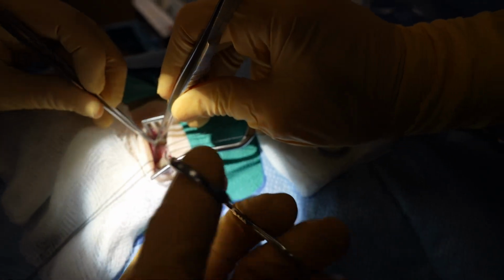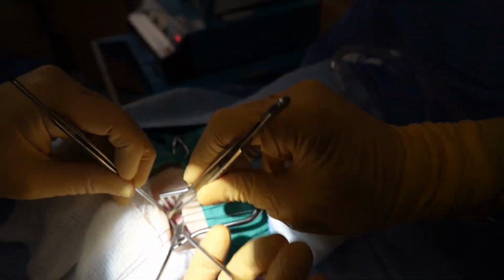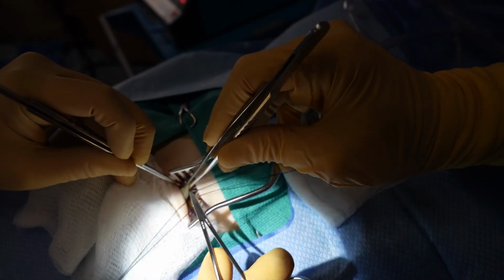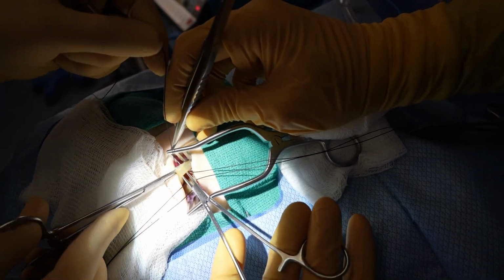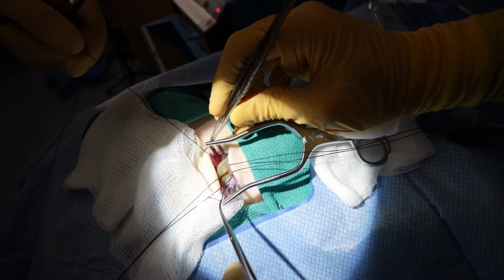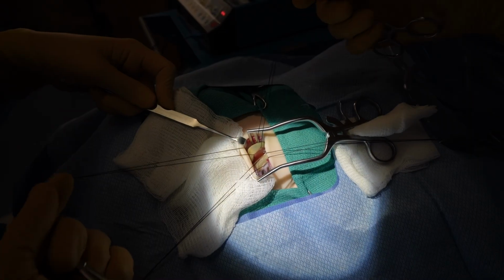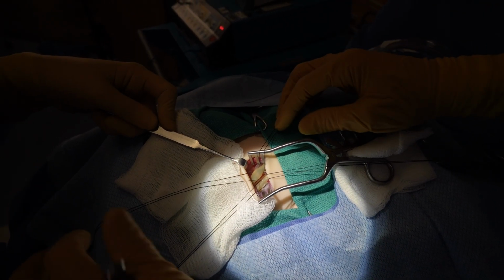Next, we will dissect around the carotid artery in a similar fashion to the vein, being careful to only grasp the artery when we need to, and then to place 2 controlling ties around the artery. Once we have control of the vessels, we can see the carotid artery, jugular vein, and vagus nerve.